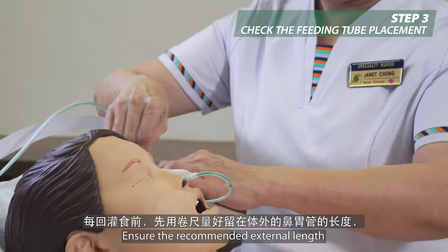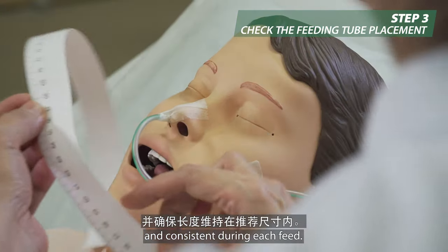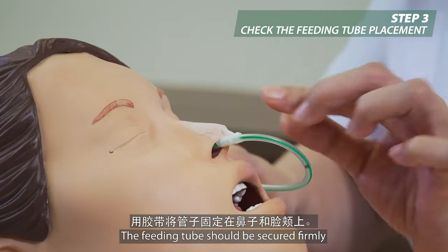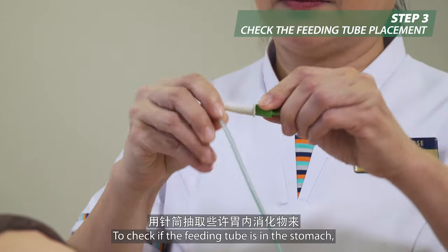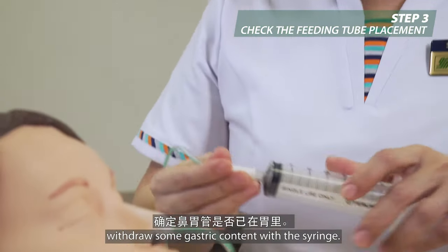Ensure the recommended external length of the feeding tube is measured and consistent during each feed. The feeding tube should be secured firmly to the nose and cheek with tape. To check if the feeding tube is in the stomach, withdraw some gastric content with the syringe.